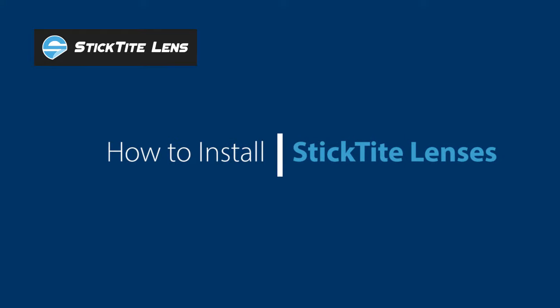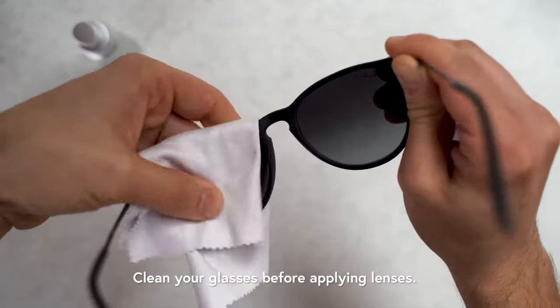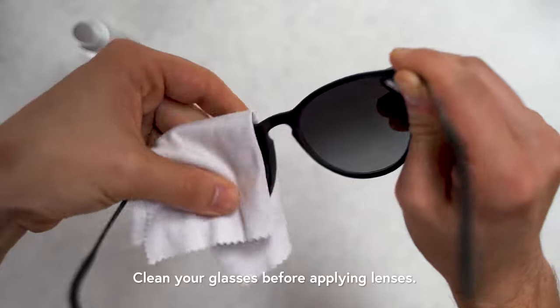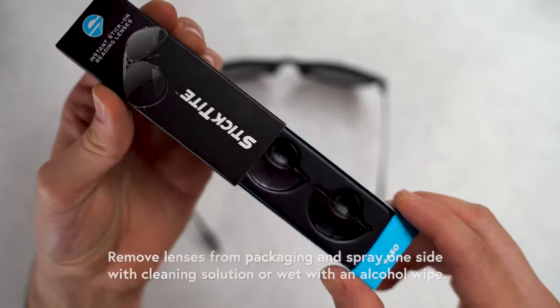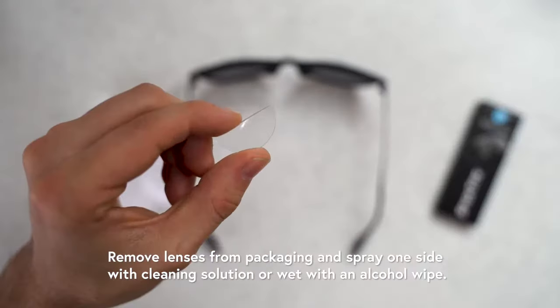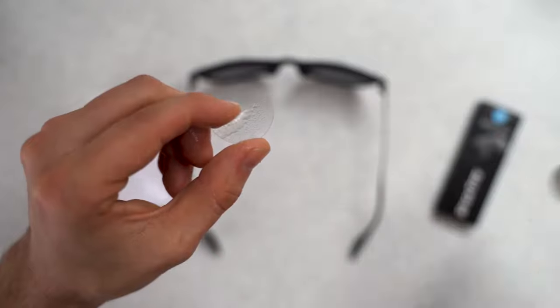How to Install Your Stick-Tite Lenses. Clean your glasses before applying your stick-tight lenses. Remove lenses from their storage case and spray one side with cleaning solution or wet them with an alcohol wipe.